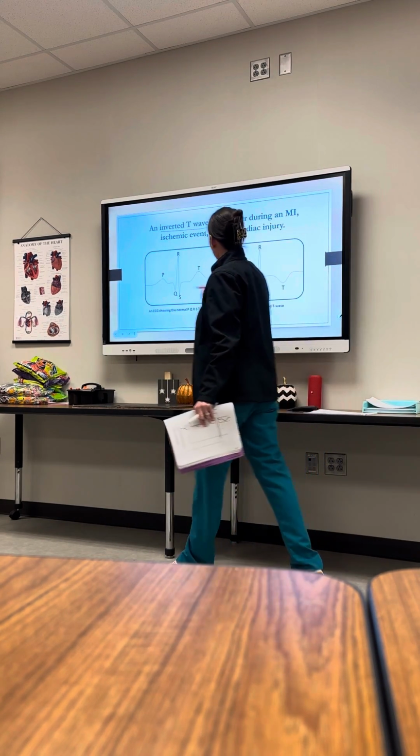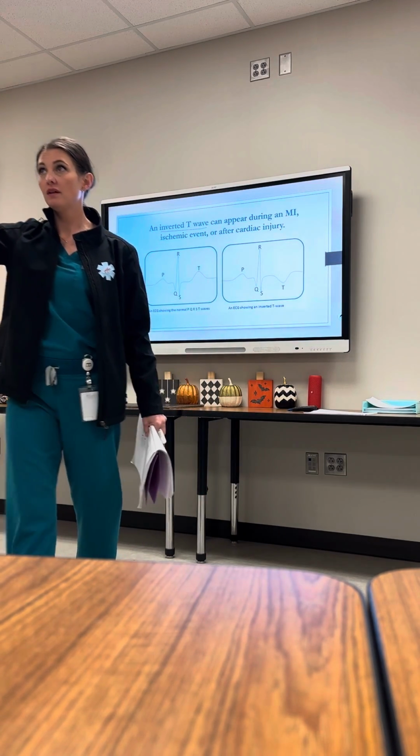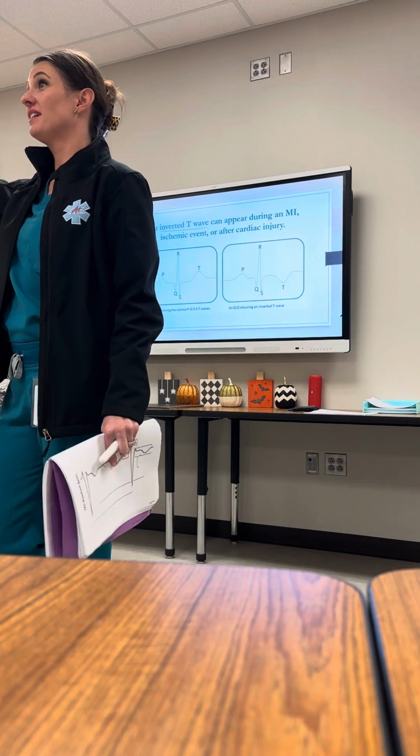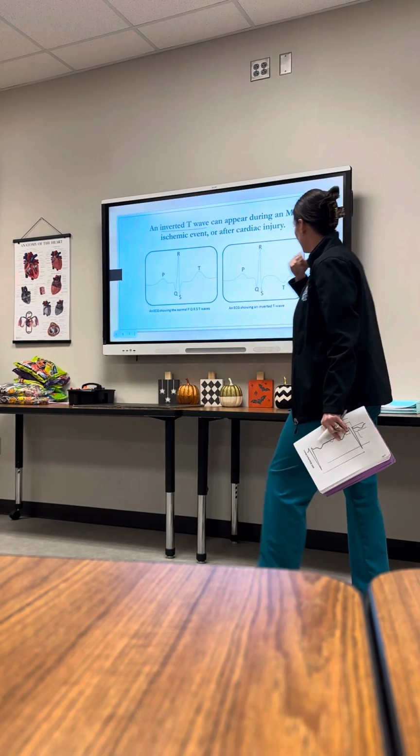Okay, so inverted T wave, let's say it out loud, could mean what? MI. MI, an ischemic event, ischemic event, or previous cardiac injury. Very good. Okay.